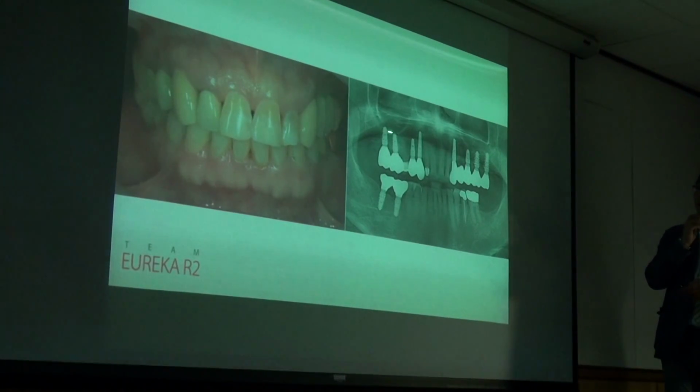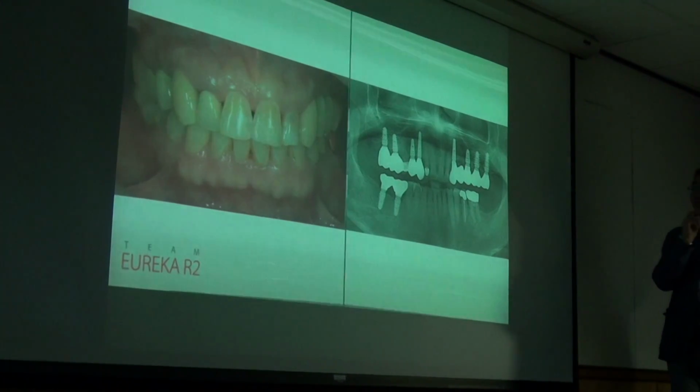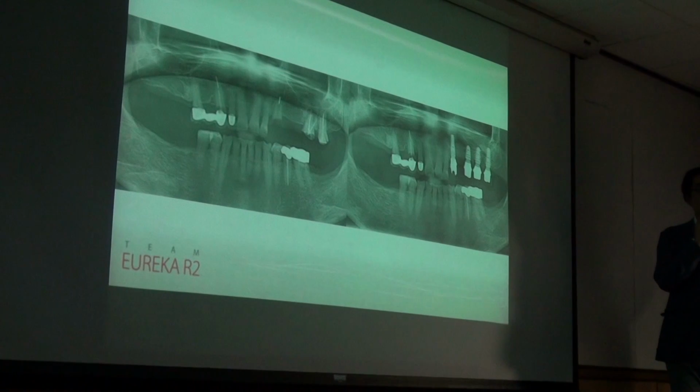So, these two implants. Actually, I always say, this patient is my mother-in-law. So this is a kind of gift. All of these implants were placed using a guide. Using a guide, we can obtain this kind of implant position. At the starting time, 4 implants were all immediately loaded, one-day implants, and she can eat with them. Then I placed 2 implants, and then 2 more. The anterior 2 are immediate loading for aesthetic reasons. The posterior ones follow conventional loading, and the other 2 implants also follow conventional loading.